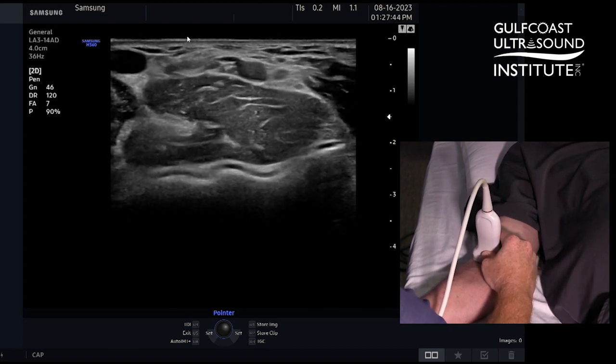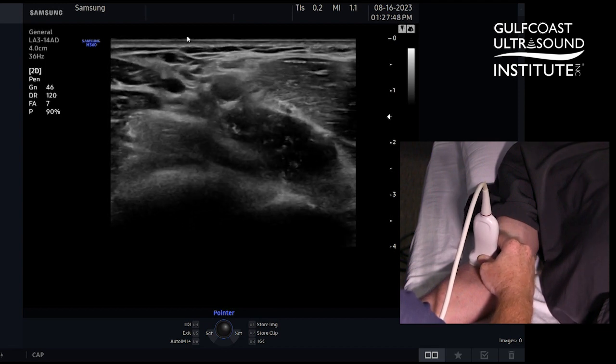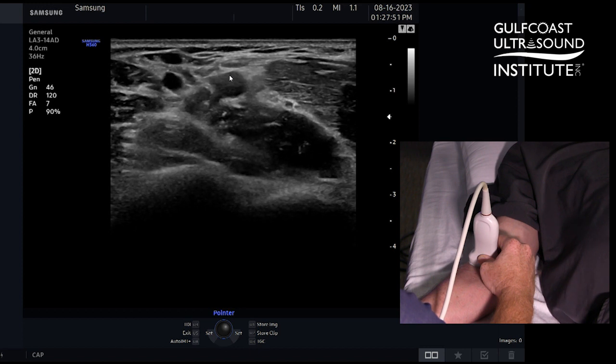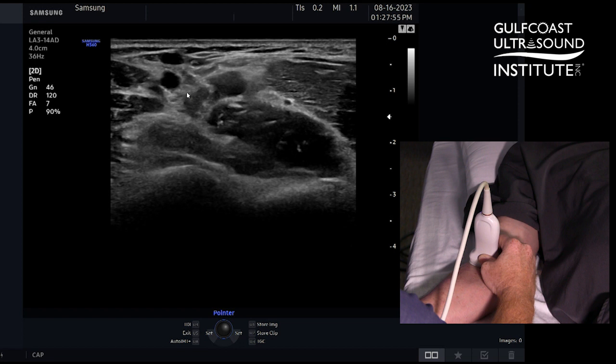We're going to scan distally down until we get a slight angle of the brachial artery — you can see that pump in here — angled down to the biceps brachii tendon.